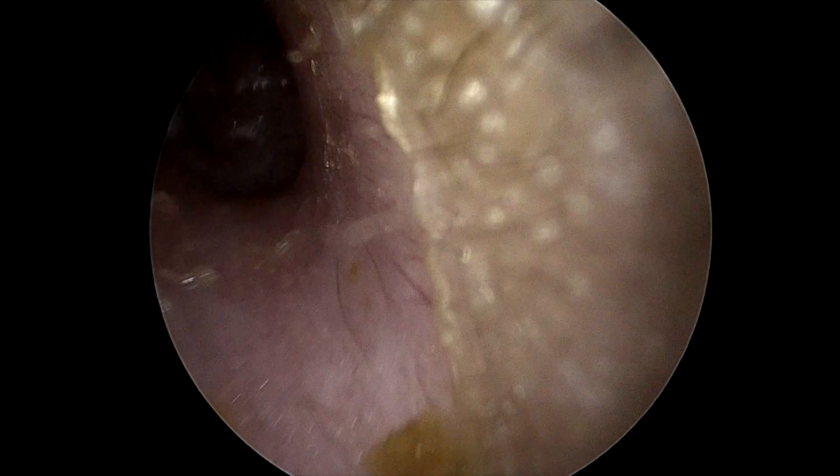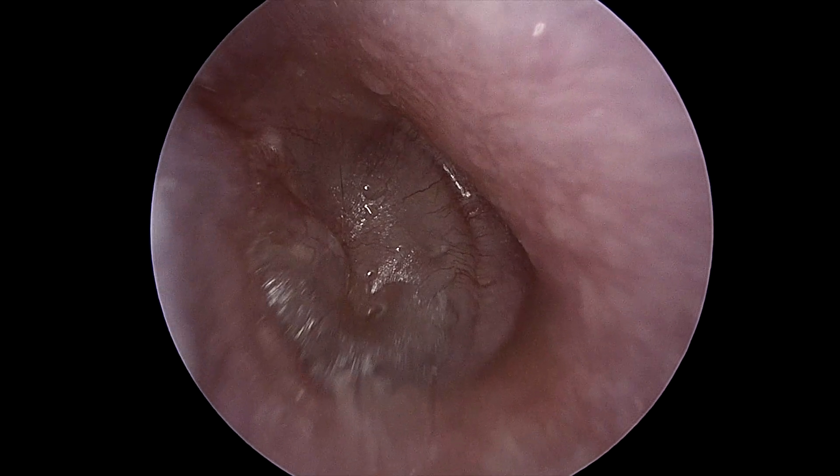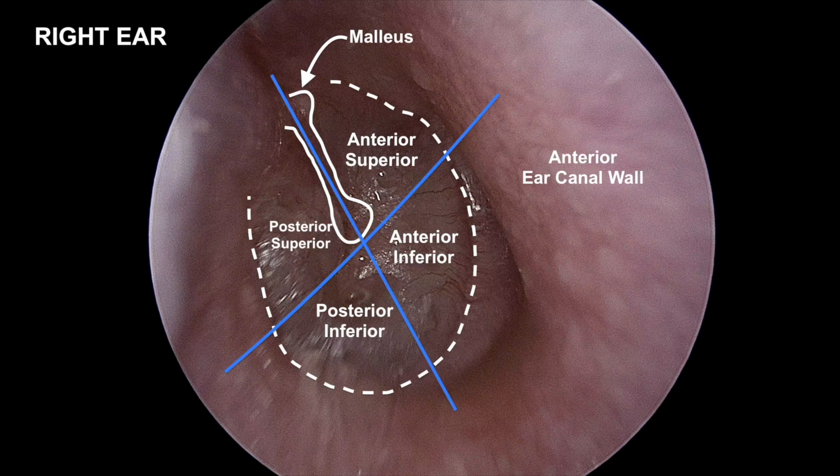Here we have an endoscopic view of a right eardrum in a child with conductive hearing loss and middle ear effusion. The malleus and four quadrants are labeled. The ossicular chain is in the posterior half of the middle ear, so we make our myringotomy ideally in the anteroinferior quadrant.